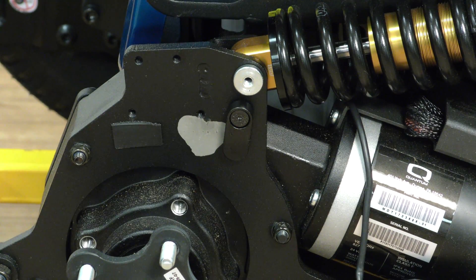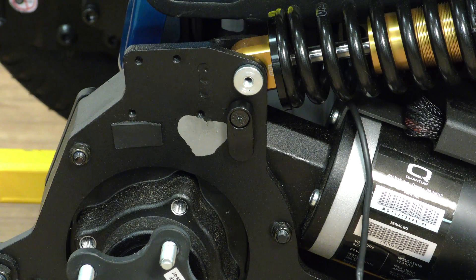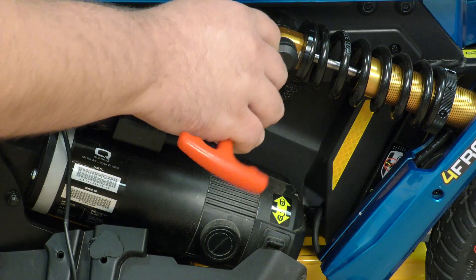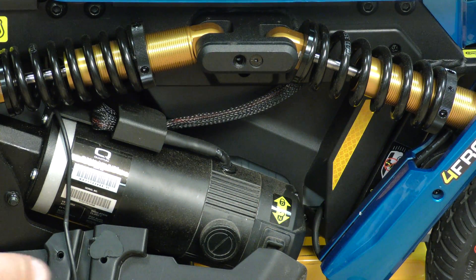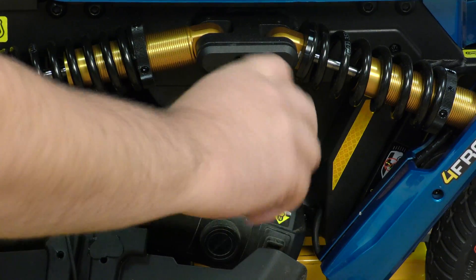Usually what I like to do, so we don't lose it, is just let it go down into the lower position and hold it in place. Then up top here, with the 3mm Allen, we're going to remove this front piece of the strut assembly.